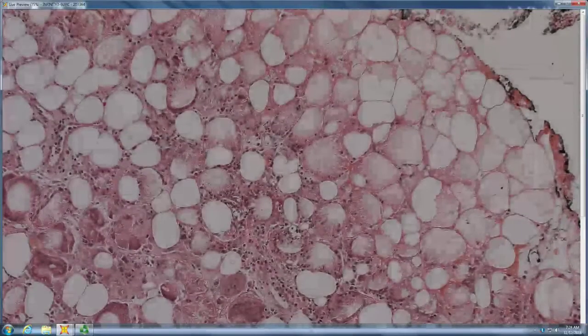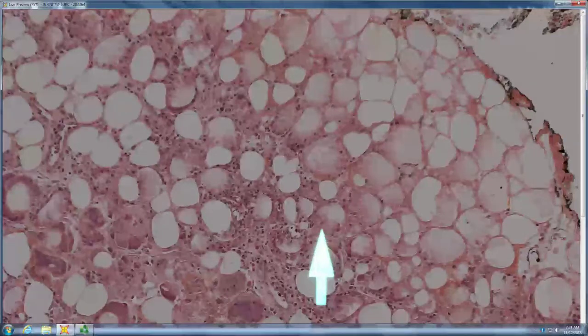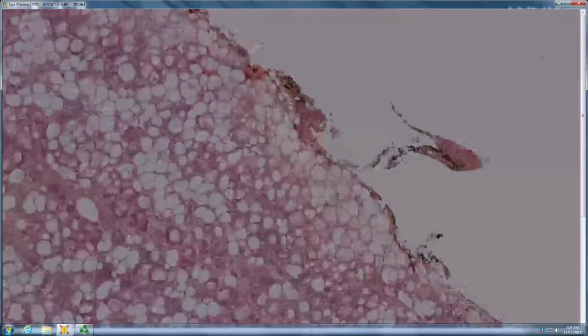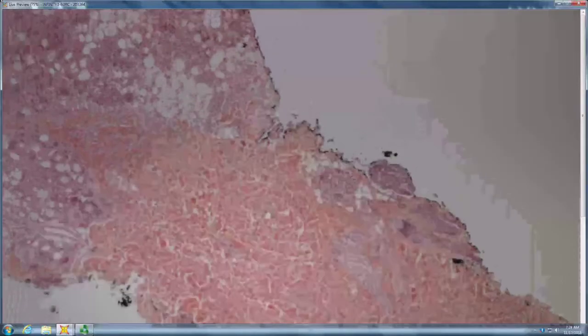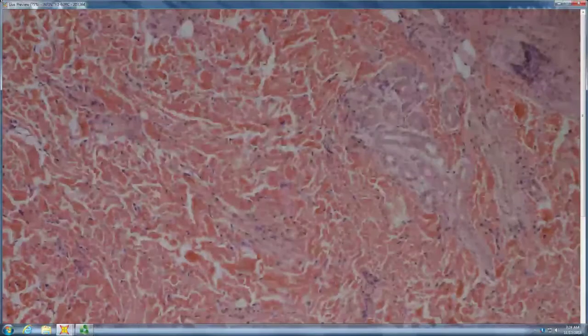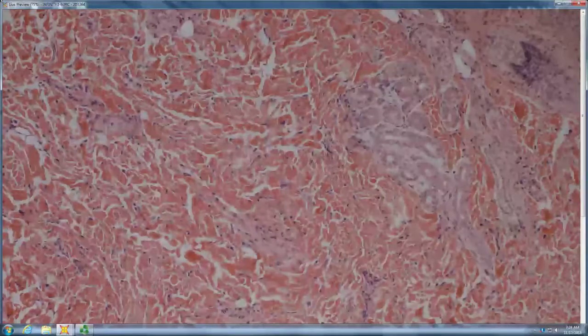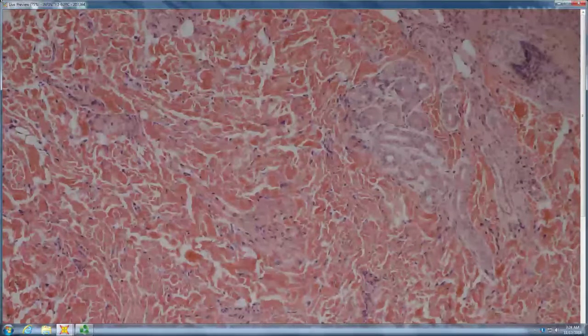It looks pretty lobular. We have almost radiating crystals. You definitely have rosettes of crystals and a granulomatous panniculitis, and it's lobular. So you're thinking. Tell me about the age of the patient based on that dermis. Probably very young. That's kid skin, right?